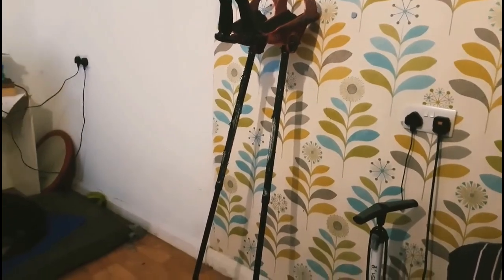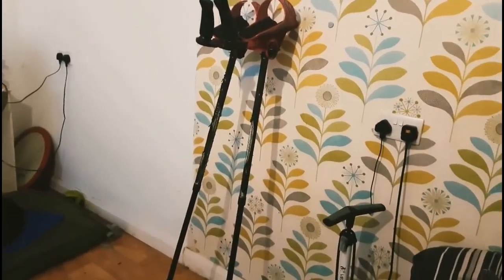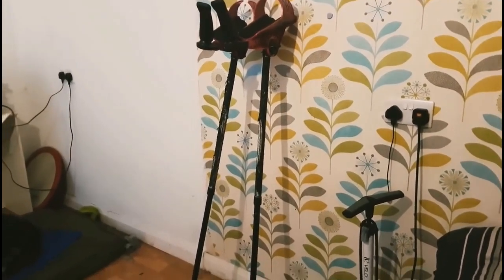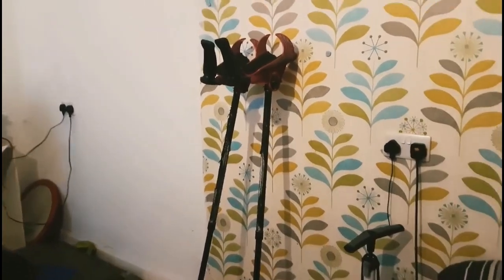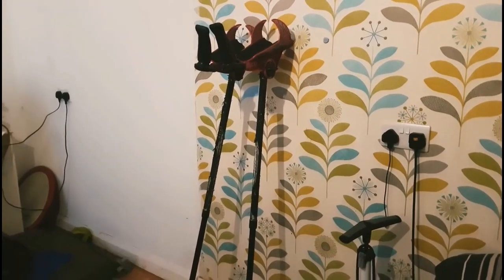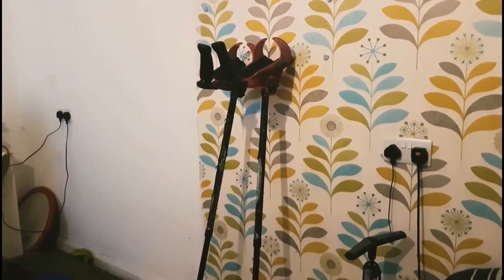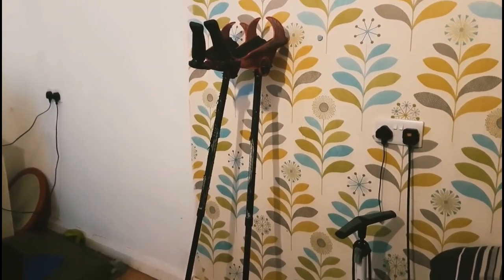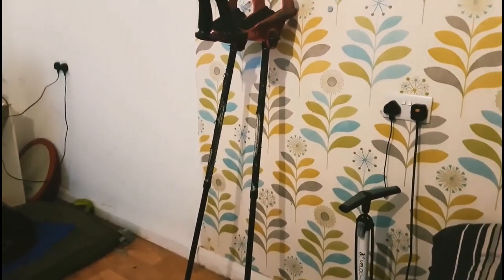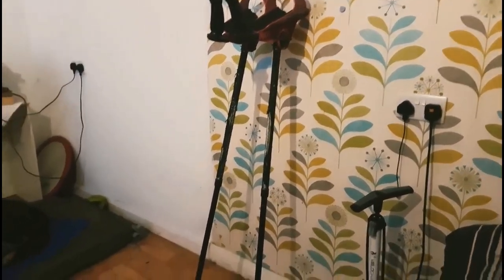These are my smart crutches, which Max has chewed up. Hey, Max, troublemaker. These are my smart crutches, which I need to use with the leg braces because my ankle doesn't bend. It makes it very, very difficult to walk. And the slightest bit of uneven ground means you can tip over or fall over. It's smartcrutch.com. They're not provided by the NHS. I had to pay for them myself because the NHS ones were so expensive. But as you can see, Max destroyed them when he was a puppy. You can have nothing in this house. They're custom built to fit me exactly. I'm 6 foot, so I need a really tall crutch.